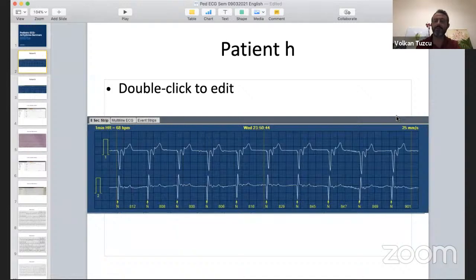Yes, good. So let me get your opinion. Somebody said junctional rhythm, another junctional rhythm. Any other opinion? Anything about P waves? Junctional rhythm with retrograde P waves. Okay, good. Excellent. So retrograde P wave. So what you see here actually is, you assumed first of all you didn't see P waves before the QRS. Therefore, you said it's junctional rhythm, right?